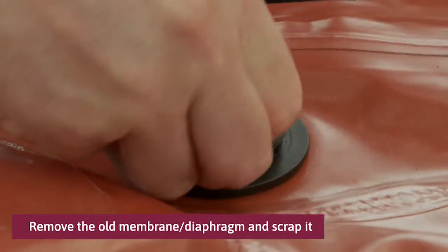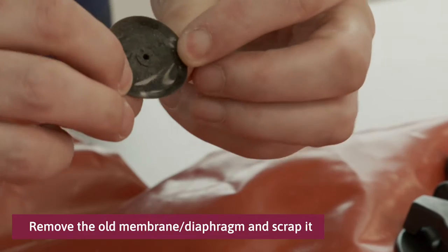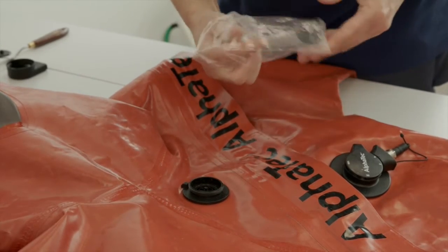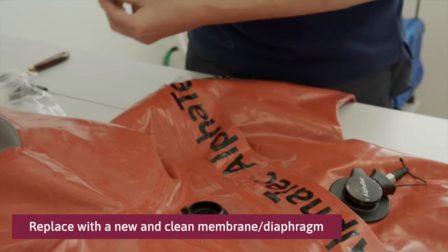Remove the old diaphragm and scrap it. Replace the old diaphragm with a new and clean one.